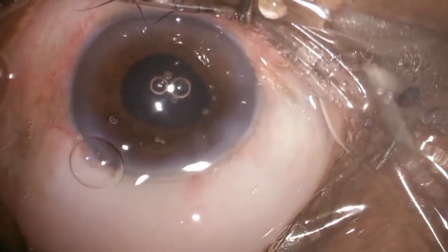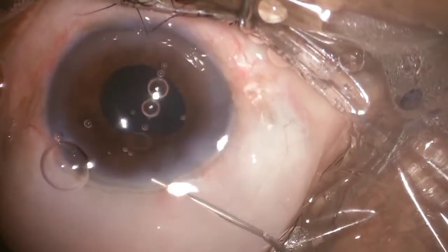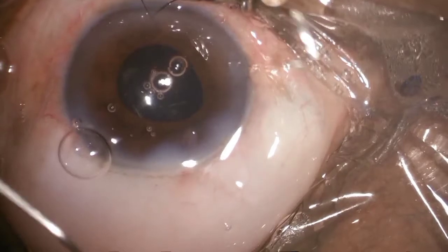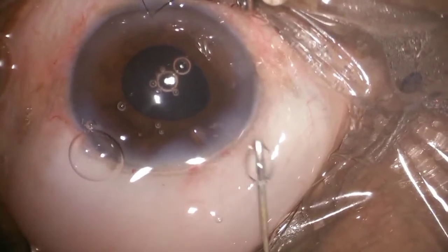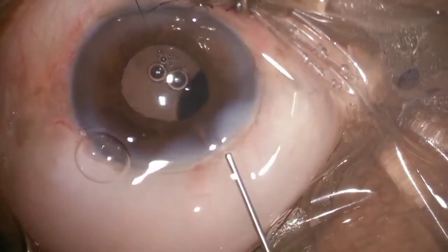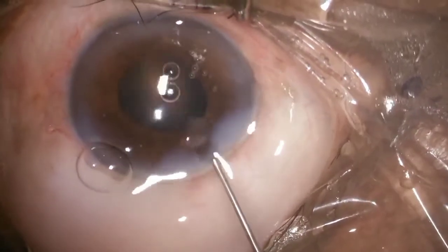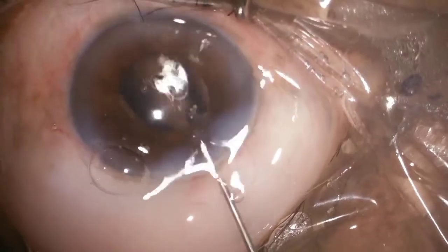When I was closing the main wound, I noticed that there was a superficial epithelial defect in the main wound. What I did, I simply repositioned it back with the help of the blunt part of the cannula.